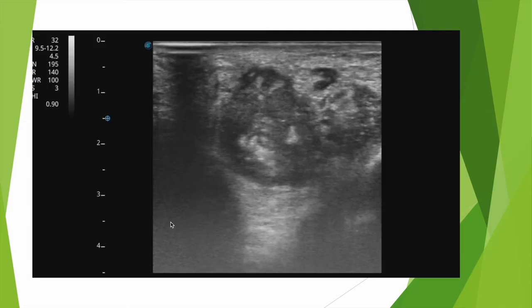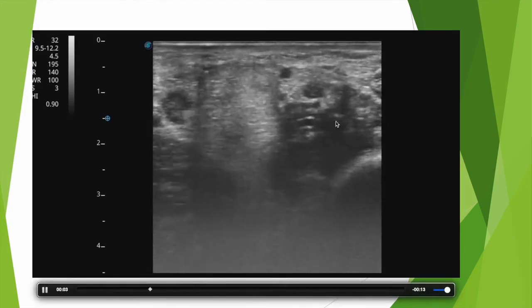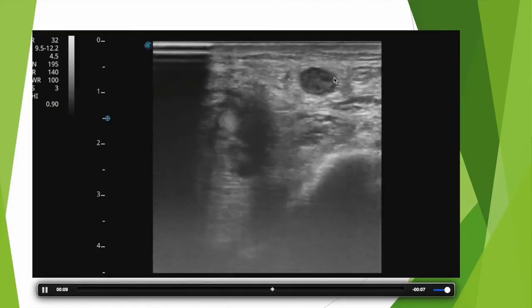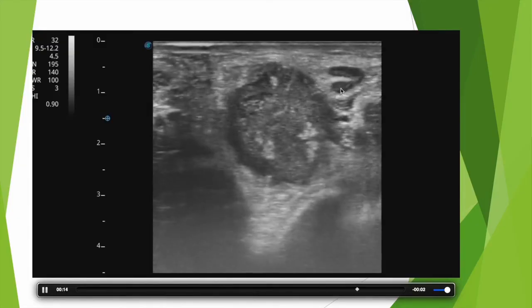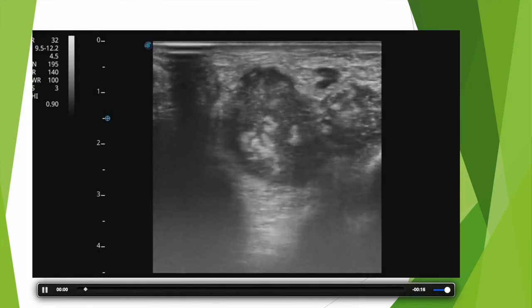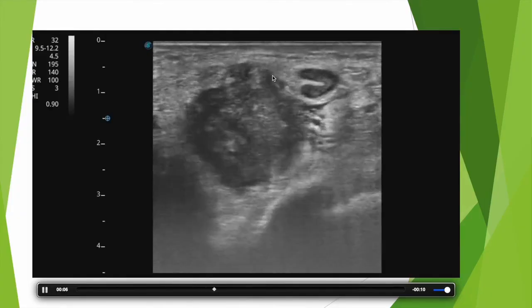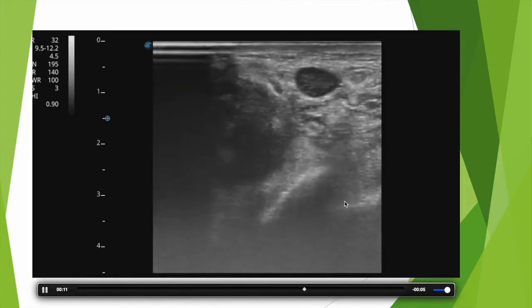So in dynamic mode, this is what the exploration looks like. Here you can see our two lymphadenopathies side by side. You can see here the absolutely intense remodeling of the area. In the end, only this lymphadenopathy is starting to show suspicious criteria. We'll get to that, but it still looks relatively normal. Here you really have this completely chaotic lymphadenopathy, very irregular, very heterogeneous, with these hyperechoic areas that we don't really understand, and this irregular outline. So there you have it, a clearly suspicious lymphadenopathy.